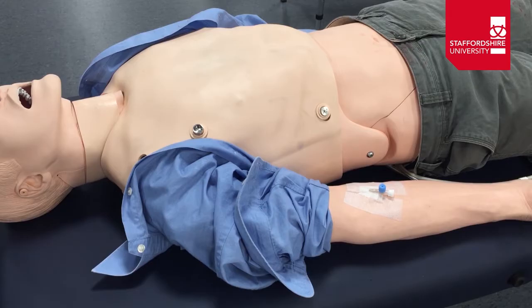Here you can see we have a patient who has been cannulated in their right antecubital fossa, or ACF, and what we're going to do is set up a bag of fluids to be able to give this patient some IV fluid therapy.